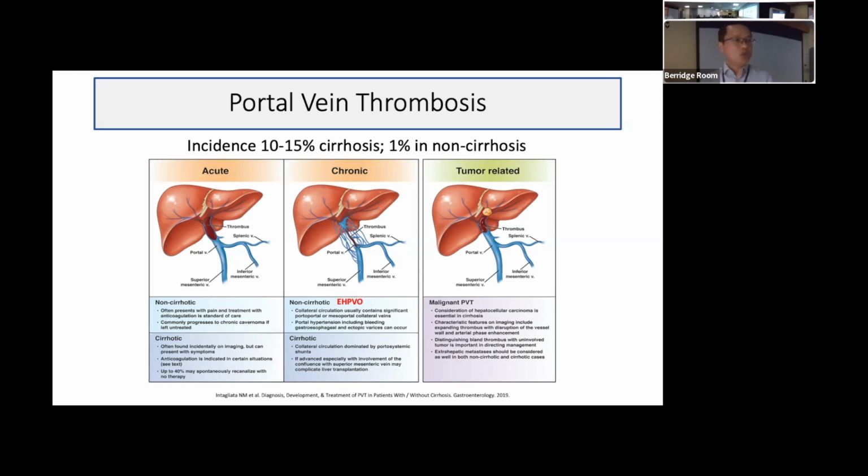That's the terminology that's used, as compared to venous occlusive disease within the liver parenchyma, which is very separate from the extrahepatic portal vein obstruction. And with chronic condition, you will see a lot of collaterals. So in this case here, you will see mesoportal and also portal-portal cavernous transformation, and also portal systemic shunts where it might lead to variceal hemorrhage.